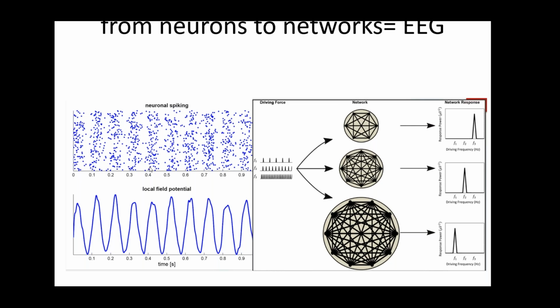When the neurons are connected in a network, the neurons fire in a pattern, and the pattern typically goes on and off at various frequencies. When you have a group of neurons firing multiple spikes, and you look at the local field potential, you will see the potentials go up and down in an oscillatory manner. That is what we can actually see on the EEG: the representation of this oscillatory depolarization of the neurons in the network.